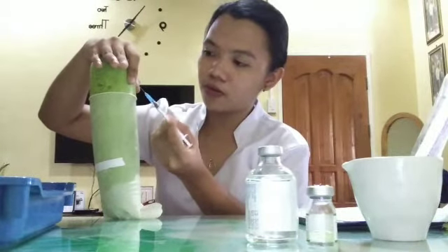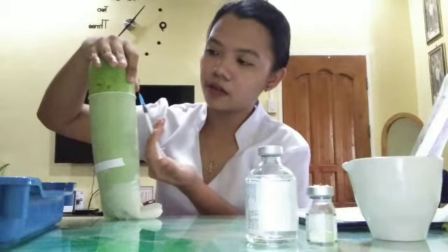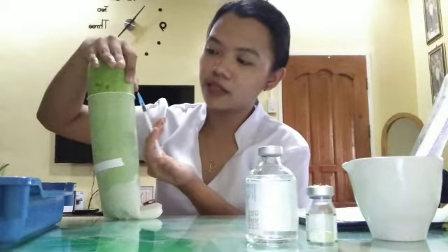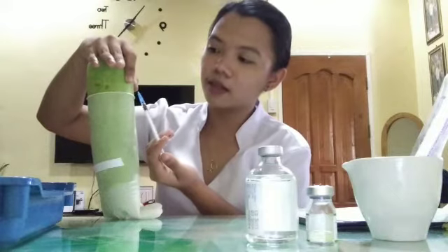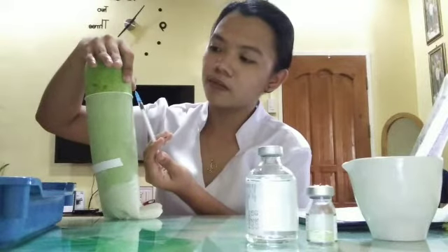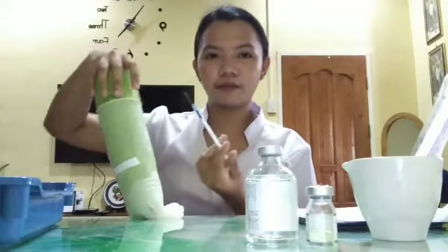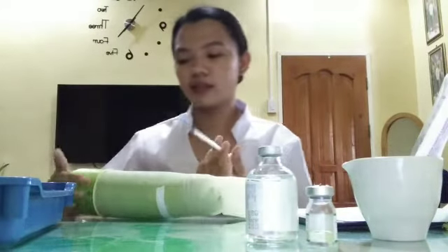So 45 degrees, insert the needle. Okay, so that's it.